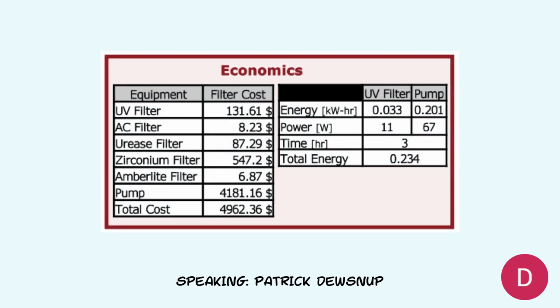Next, we'll be looking at the economics for the project with equipment cost and energy consumption. The cost of each filter was based on optimization through theory, with consideration of materials being bought in bulk for experimentation purposes. It is assumed that each filter would be replaced on a weekly basis and that we would be using 3-hour treatment cycles for power consumption reasons.